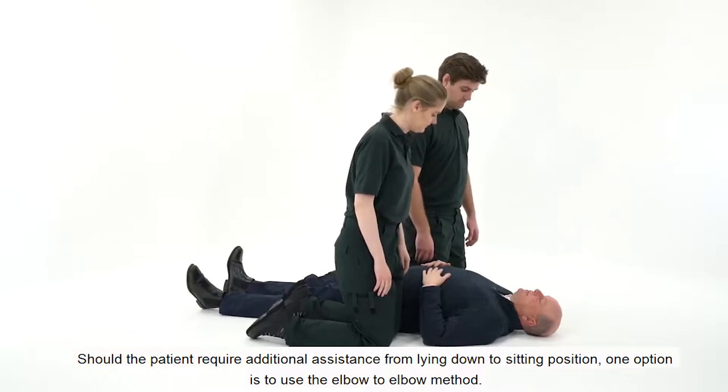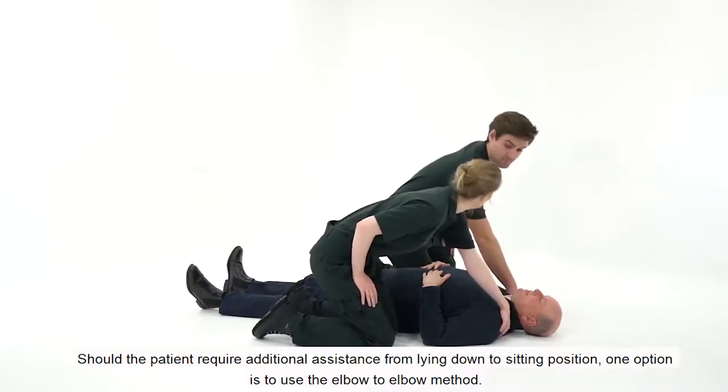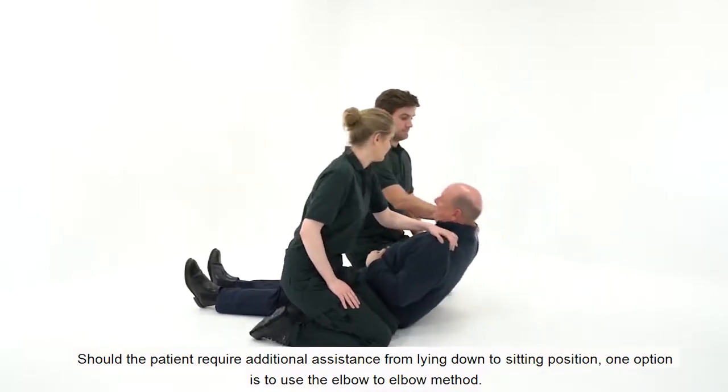Should the patient require additional assistance from lying down to sitting position, one option is to use the elbow-to-elbow method.